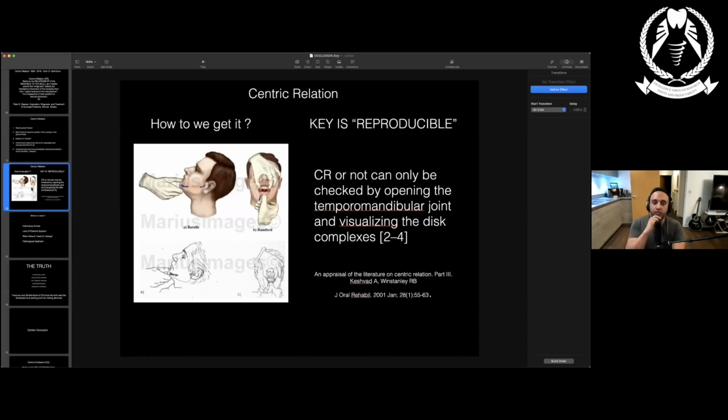And suddenly you'll place your hand here and you'll feel that mandible just click backwards. And you go, there you go, that's it. And your patients will laugh after that because they're not even conscious that they're posturing their jaw forward. So you're trying to get this reproducible position, but you've got to get your patients relaxed to get into that position. You've got to identify when they're posturing that mandible forward, because often they do it unconsciously.